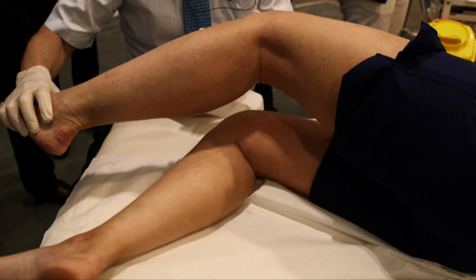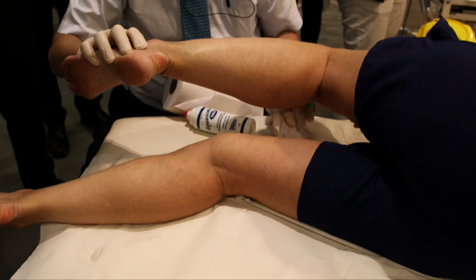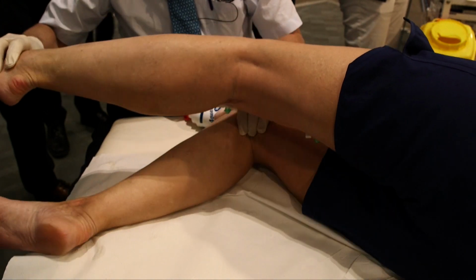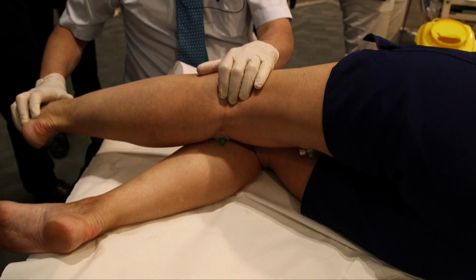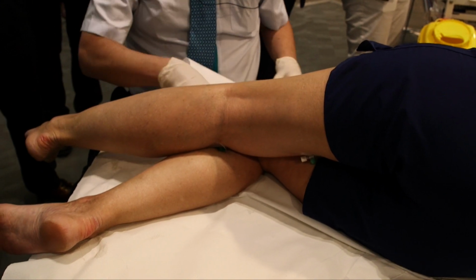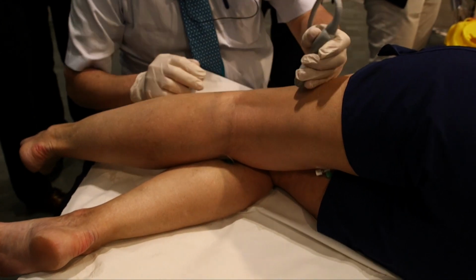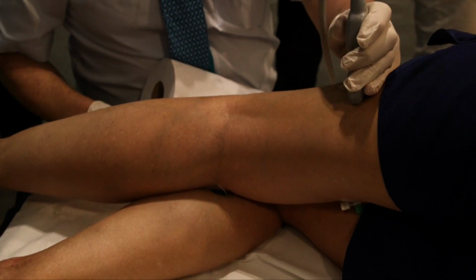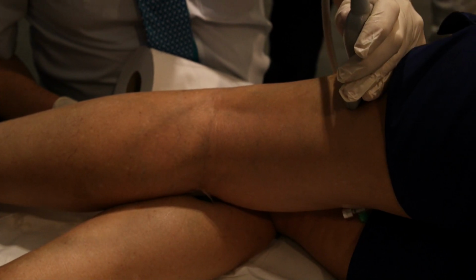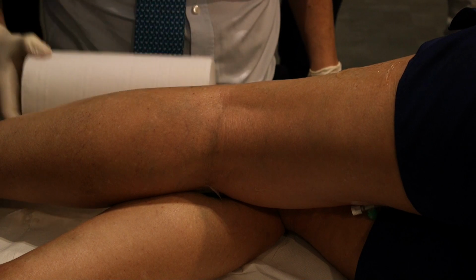And if you leave this leg in here. Oh, wait a minute. If you bring this leg back a little bit, we should be able to rest that down without causing you too much discomfort. Is that okay? The cannula's a bit angular. The plastic bits tend to stick in the other leg. So that brings us to this. And I'm just going to see if I can put a 22 gauge pediatric cannula in there.